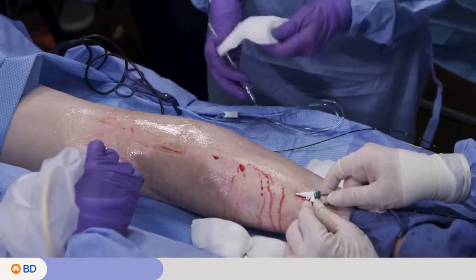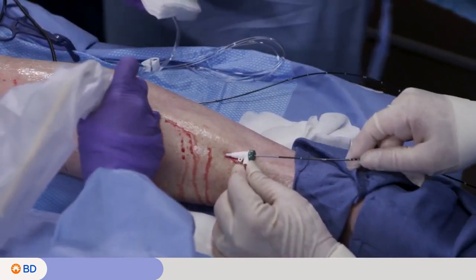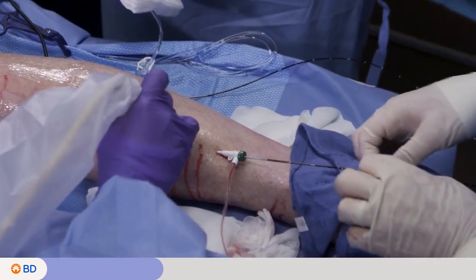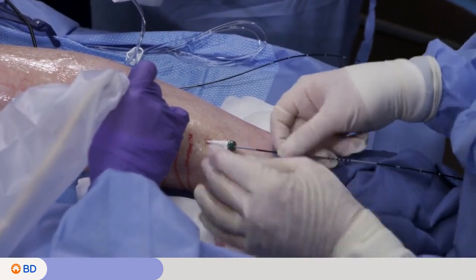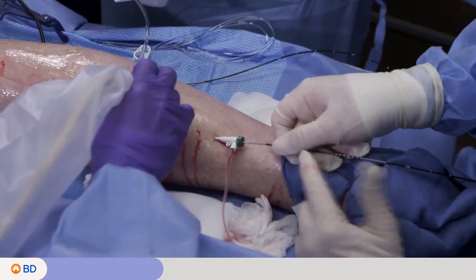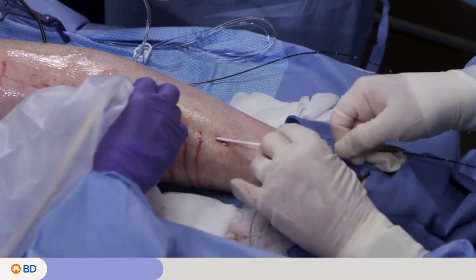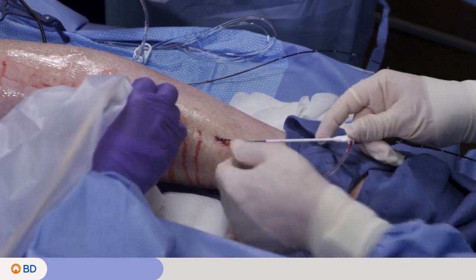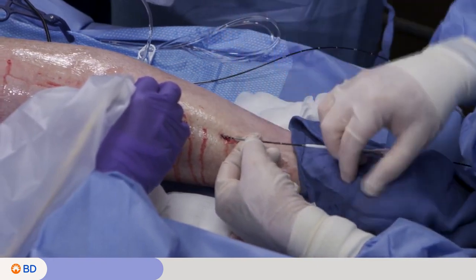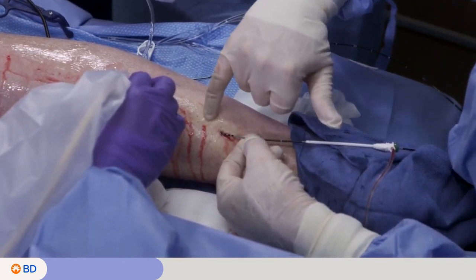So I'm going to pull back again because we treated that, and we did 1, 2, 3, 4. That's 10. So that's the same. And now it's very important as you get past this warning track that you don't treat without seeing your coil. So I like to anchor the catheter and then pull the sheath out of the body without moving the catheter position. So now I have the sheath out of the body, and I see the other warning landmarks, and I have the double X. So I know that the end of the catheter is right here.